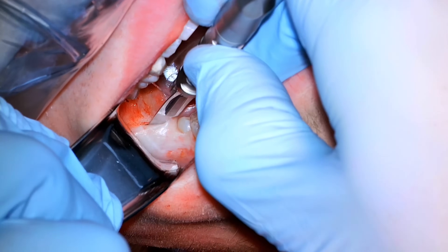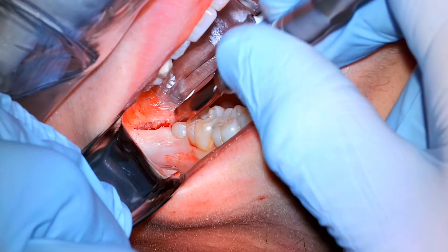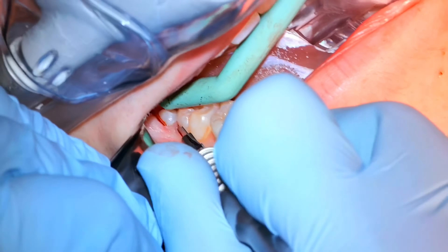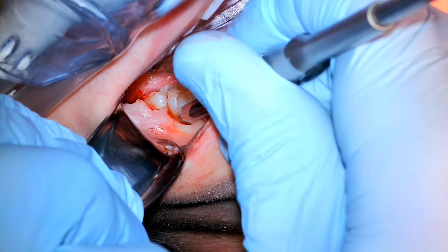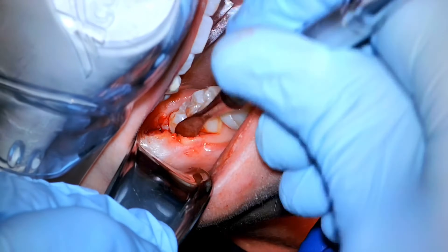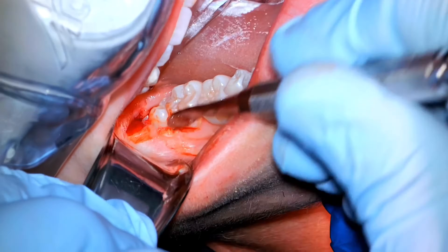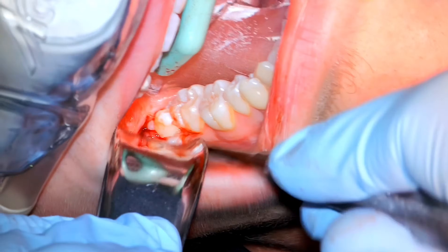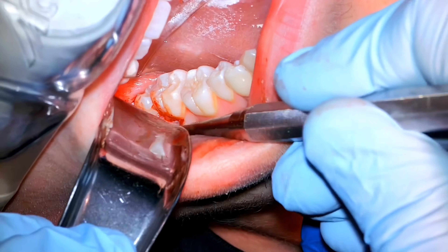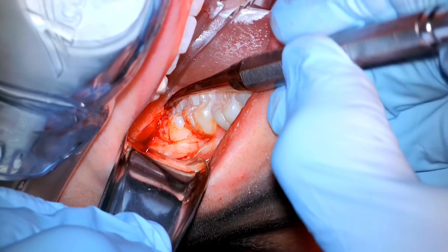Lots of pulling on the cheek here — the key is to really stretch that tissue tight. It helps with the incision and allows you to cut a little more laterally toward the retromolar area. We're just going to release the papilla there and come up around here. So we're demonstrating a slightly different flap — I do lots of triangular flaps, but I also do envelope flaps depending on the case. This one here we're choosing an envelope flap, just opening that up and making sure we have good access — it opens up quite nicely, certainly adequately for what we need.